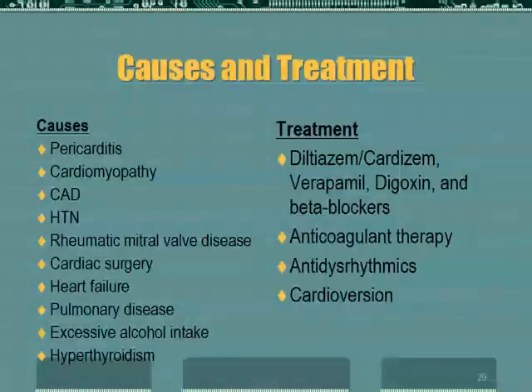So many times this patient may have this done as an elective procedure, and the patient will be sedated with medication before it's done. And the patient obviously is in a center where, in case the patient would have an adverse reaction to it, everything is set up, with resuscitation equipment nearby and available for that patient, just in case there would be an adverse outcome from the cardioversion.